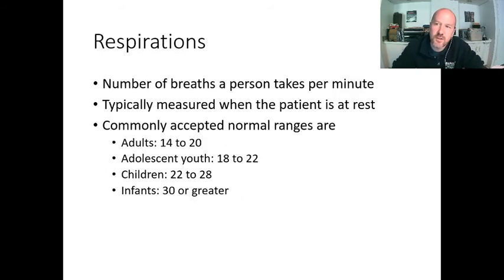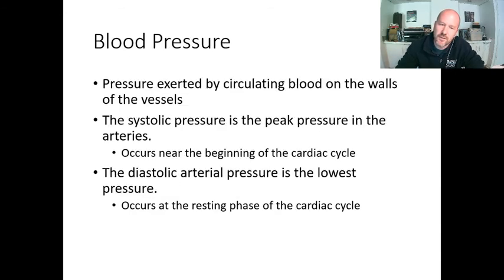Respirations, you can count respirations pretty easily. And again, these are super helpful to have if the patient's having a contrast reaction. It's helpful to have what their normal respirations were prior to the contrast reaction. That's super helpful. Once they're having the contrast reaction, if you don't have the normal stuff, you're kind of up a creek. So do it before you administer contrast.